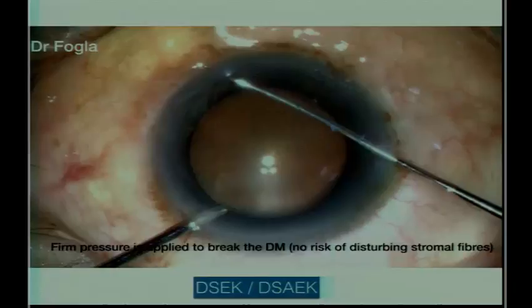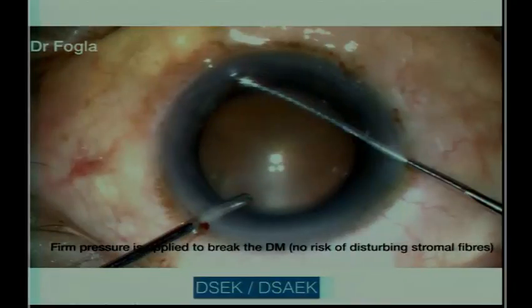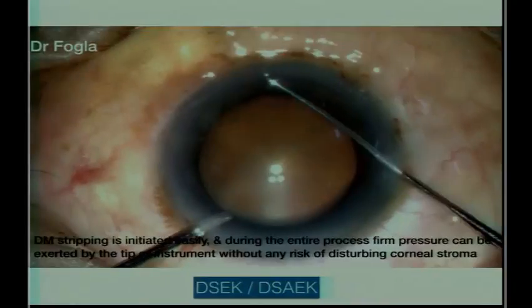And even if you do the best centration, you find that the donor Descemet's is not exactly in the area where you have stripped. So sometimes one edge is overlying the area where the Descemet's is still intact, but I have not seen any increased rate of detachment in the area where it is still present. So you can see in this video, we use the tip and we press on the stromal surface.